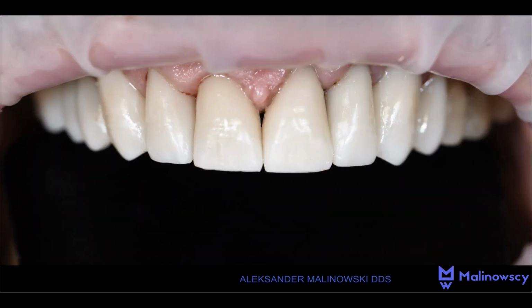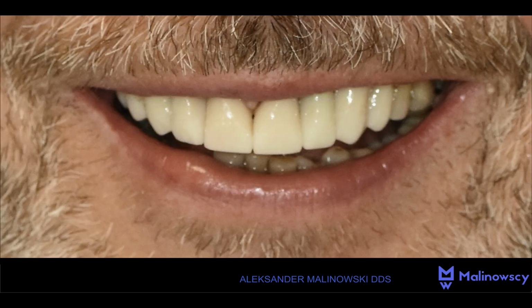Okay, here we can see the condition after fitting temporary crowns. Please notice how the shape of the papilla changed during the time. Okay, this is the smile with temporary crowns.